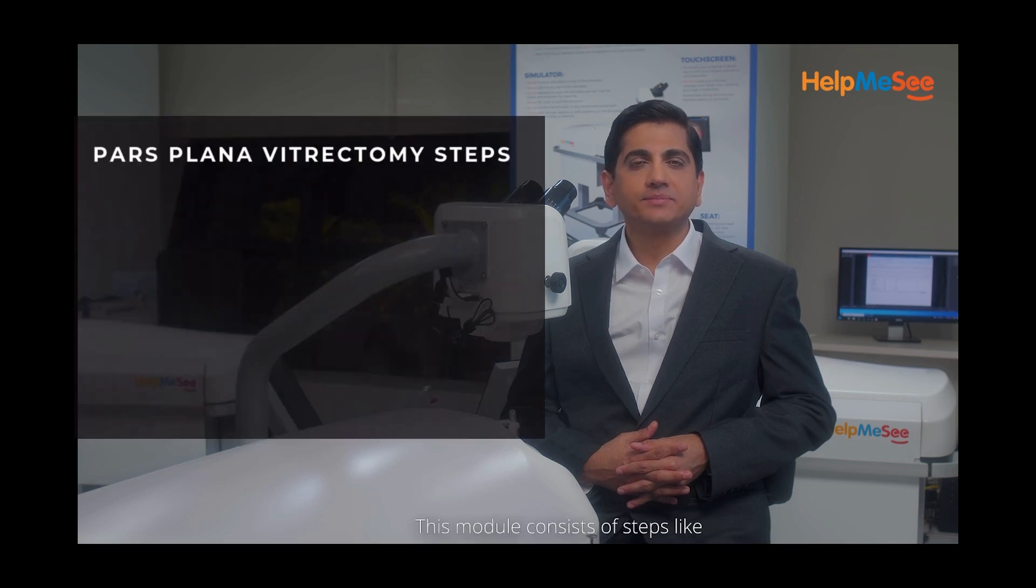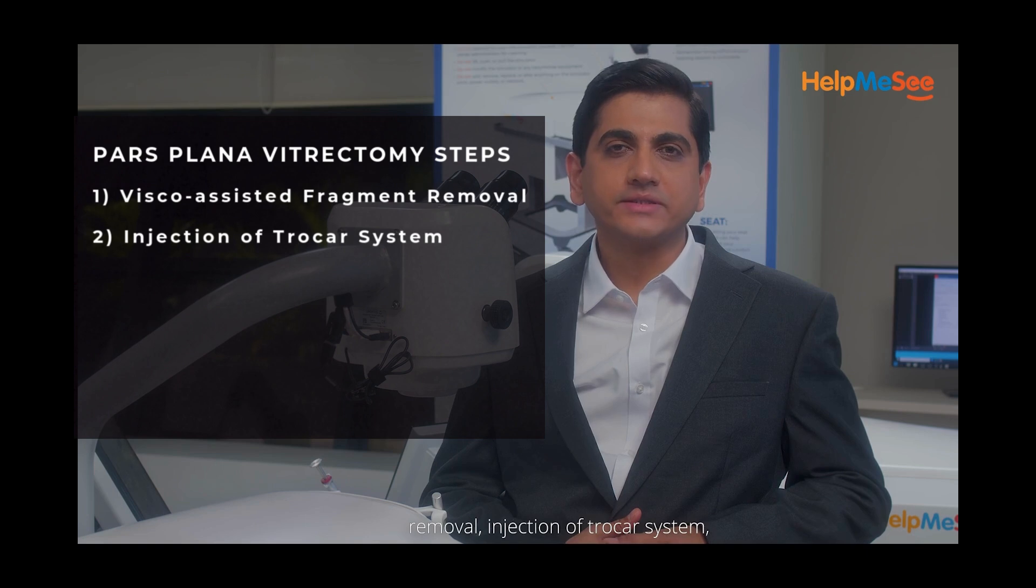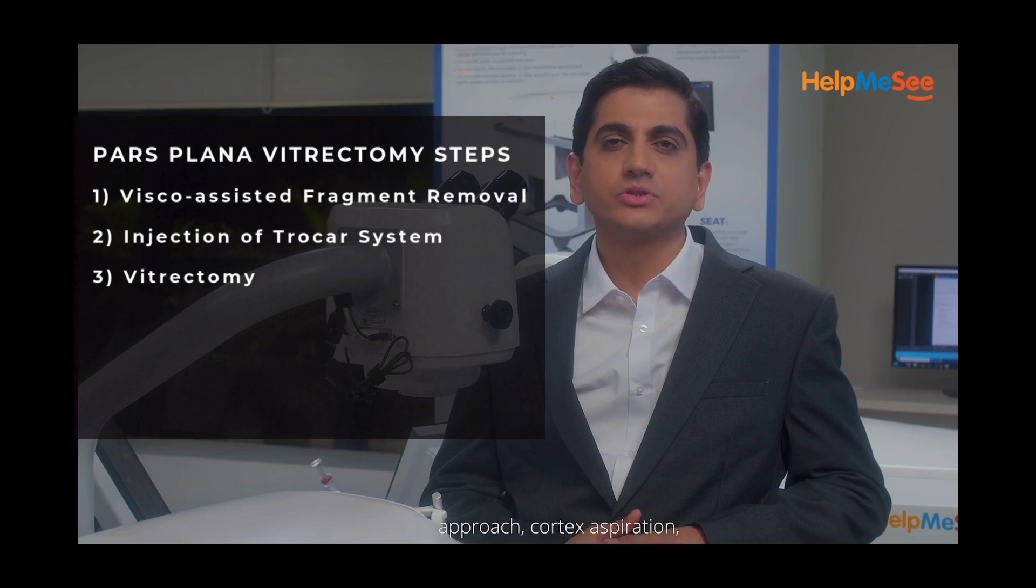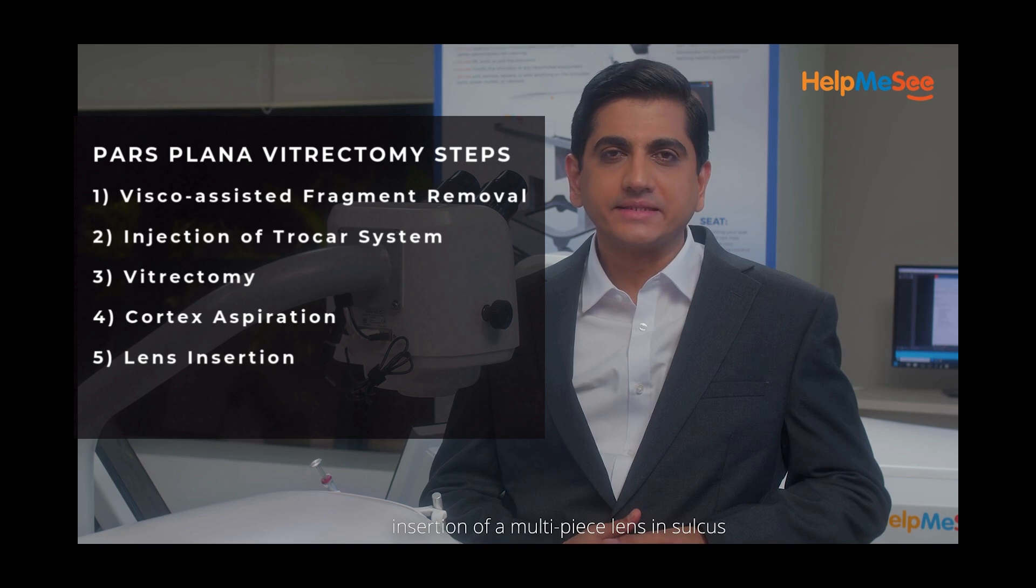This module consists of steps like visco-assisted fragment removal, injection of trocar system, vitrectomy through the pars plana as well as through the limbal approach, cortex aspiration, and insertion of a multi-piece lens in sulcus and removal of the trocar.